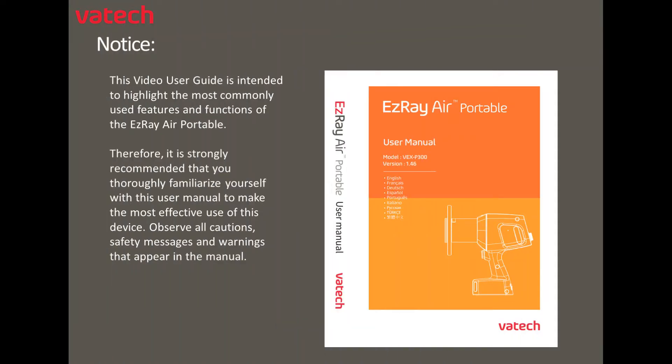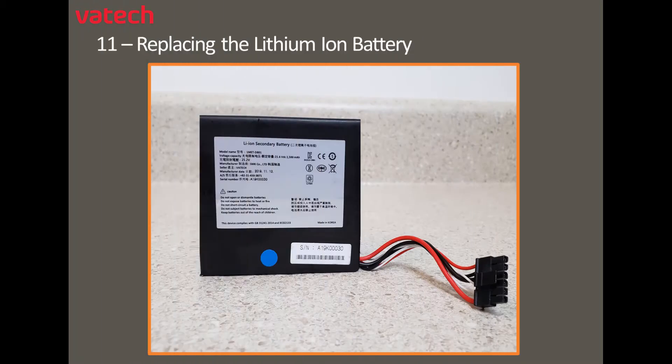Notice: please review the recommendations as they relate to the Video User Guide and the Complete User Manual. Let's get started with replacing the lithium-ion battery.